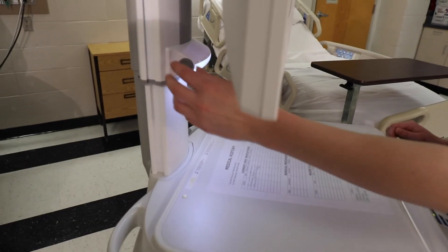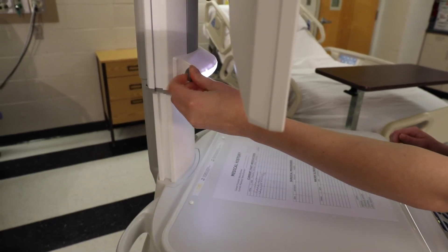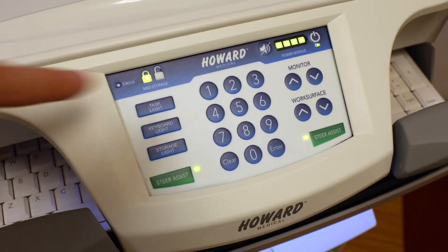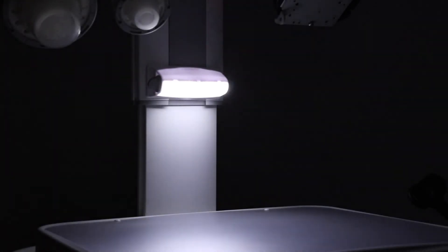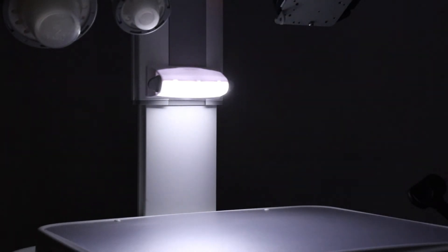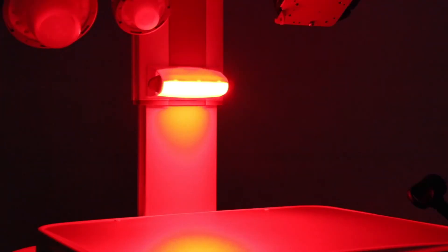For low light conditions, the cart is equipped with a task light. Press the task light button on the left side of the keypad to activate it. Pressing the button again cycles through normal, dim, and red night mode. The night mode is useful for retaining the user's low-light adjusted vision and not disturbing patients.